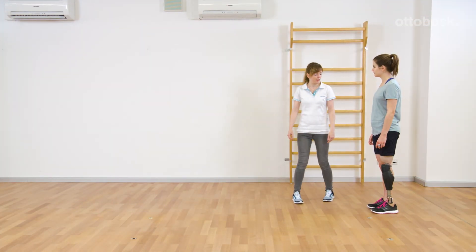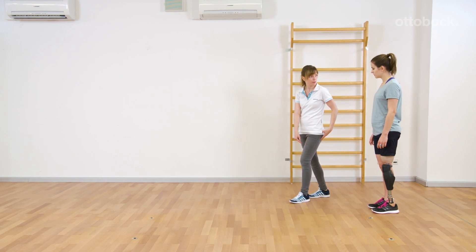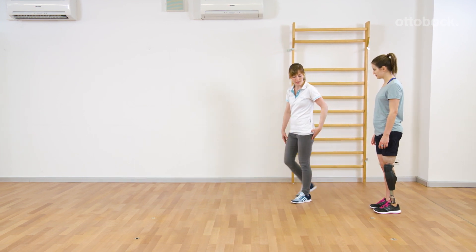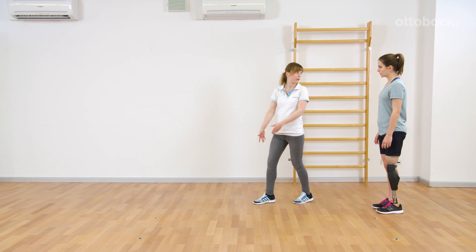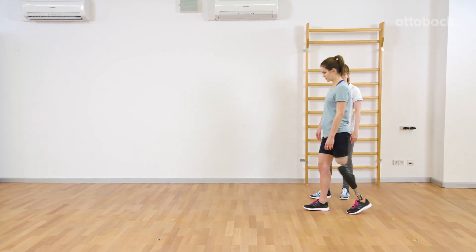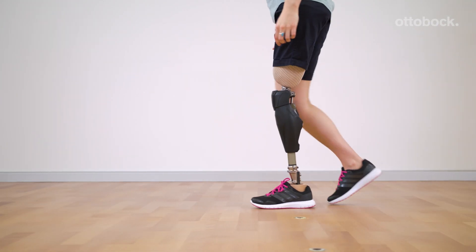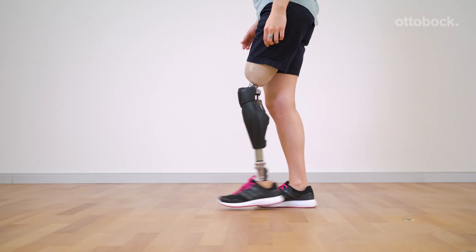When observing physiological gait, the knee joint bends slightly during initial contact and loading response. This movement serves as a shock absorber, relieves the musculoskeletal system, and provides safety through a faster foot-flat position. Genium supports this motion pattern by the 4-degree pre-flex of the knee joint.